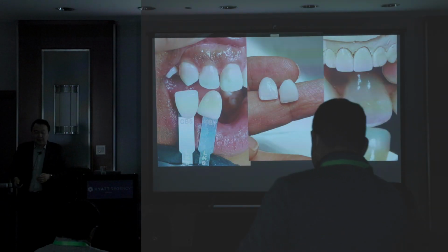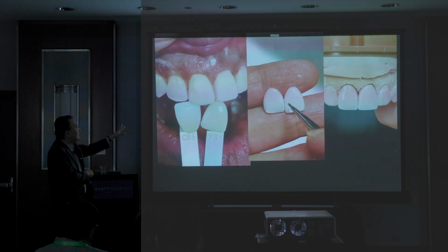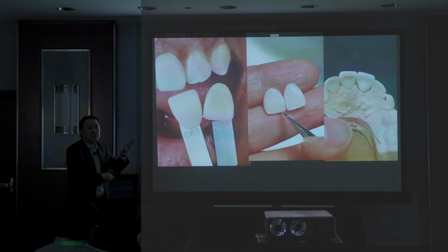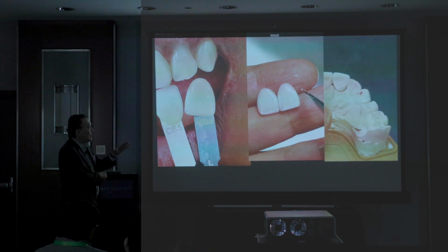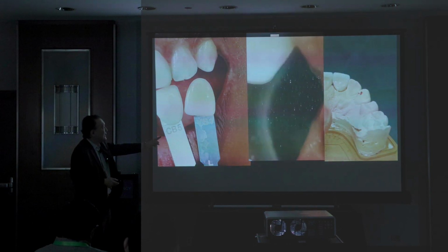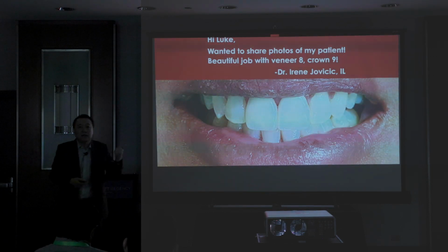I was not used to it, so I worked really crazy every day. Probably I worked 10 hours a day to produce the case. I don't concentrate on much crown. So this is veneers. Concentrate on the two centrals and then make certain of the value, but most of the times you cannot make the value, right? So you have to utilize the value from the original tooth. For example, the doctor prepped the teeth, and then we have to find out what color is underneath. And then externally you can cover with white stain, and then bake it, so you can make that one just like that. Sorry, the color is not that great, but anyway, they try it in the mouth.